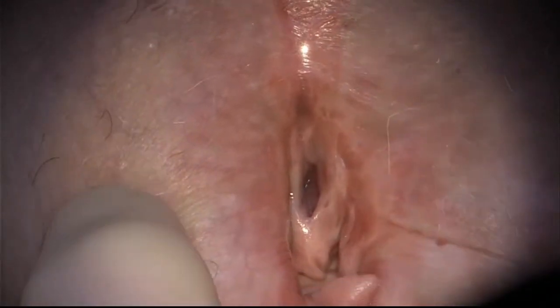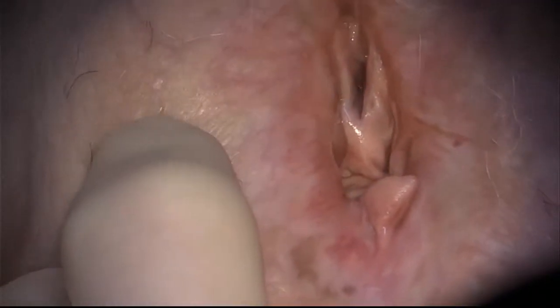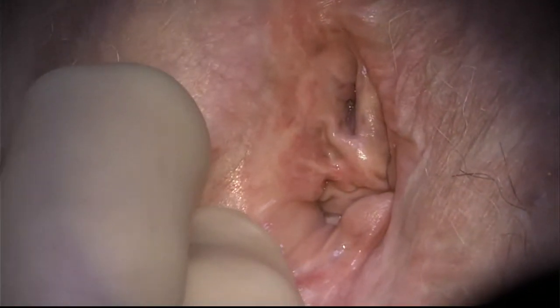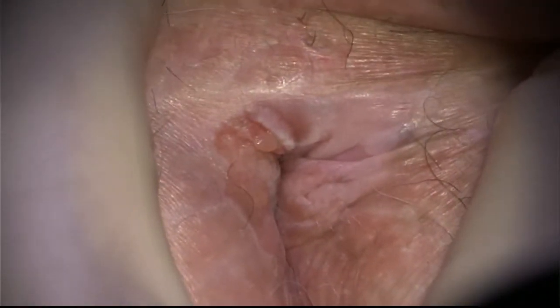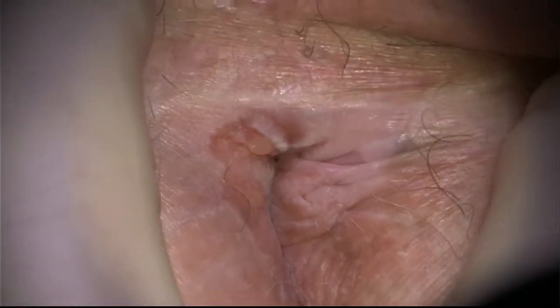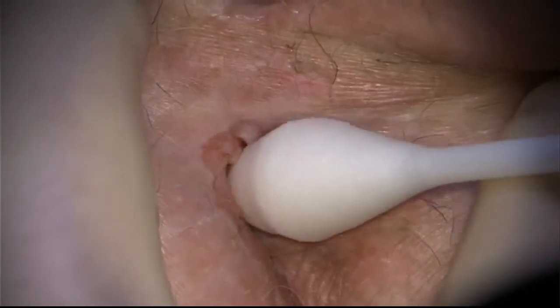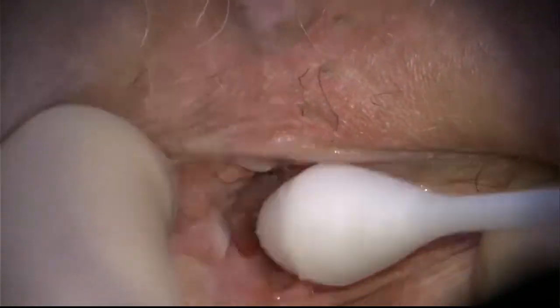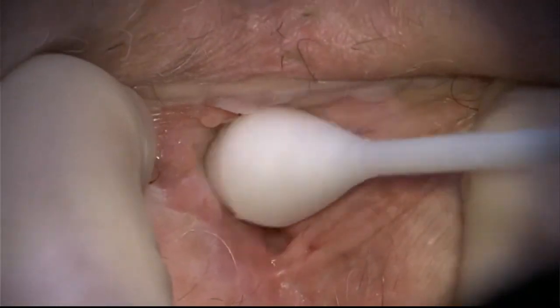The vaginal opening has had laser destruction, as evidenced by the tanning effect with the pigmentation at the edge of the laser scar. This is the appearance of the anus with some acetic acid being placed.